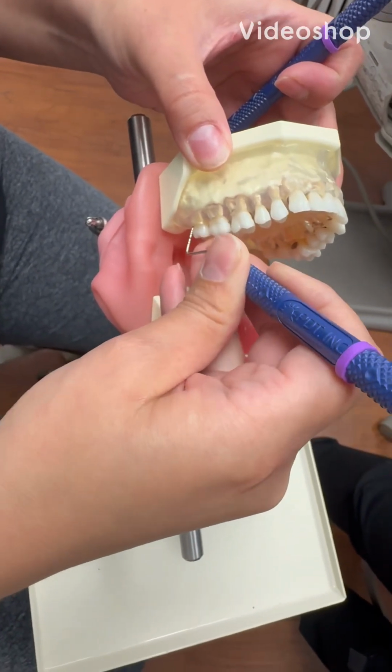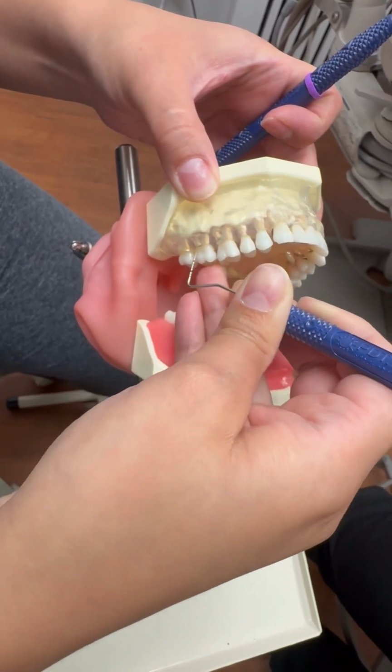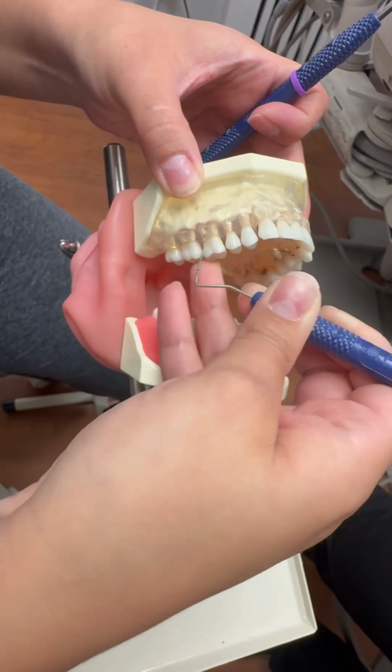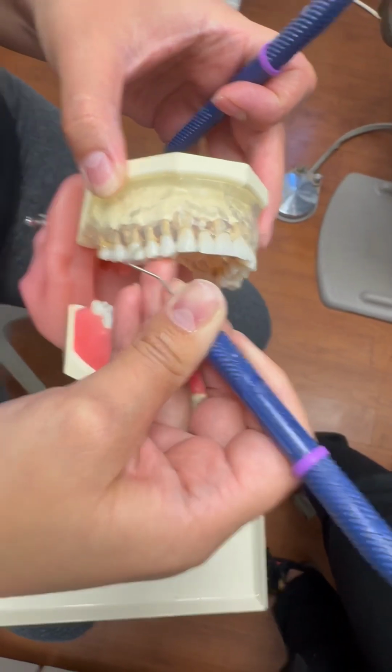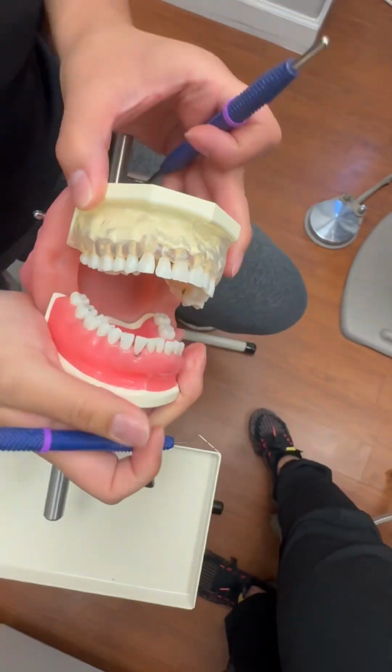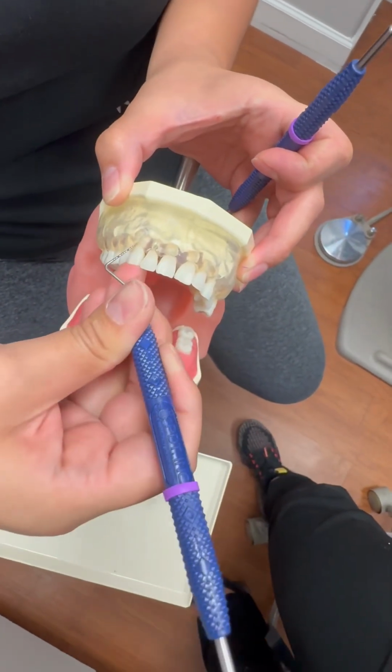In this video, I'm using the University of North Carolina 12 probe. This probe has some lines that are 1 millimeter away from each other. It also has two thick lines that indicate the 4 to 5 millimeters and the 9 to 10 millimeters.